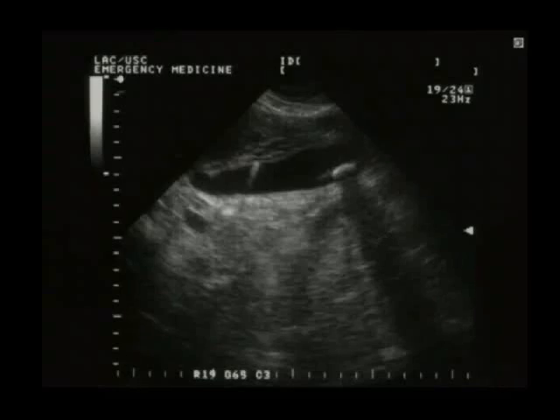Point out the liver edge that you're using to use the marker. Okay, the edges of the gallbladder: one here would be one edge, and this would be the other edge. And you always measure the proximal wall.